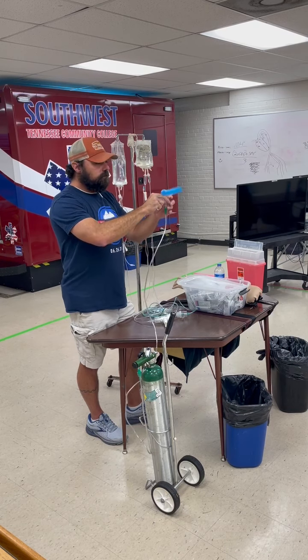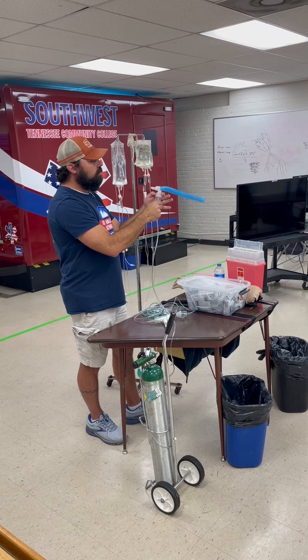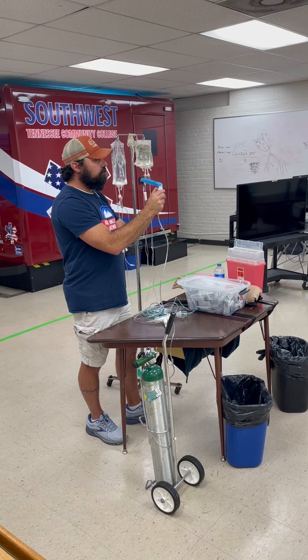This one here has this long, little bendy, flexy thing here. Nobody in here is old enough to remember what a popple was from McDonald's, which is sad to me. It means I'm old. But this is a spacer. This is to keep your medicine from wasting out too much. Obviously, they breathe in from this side.